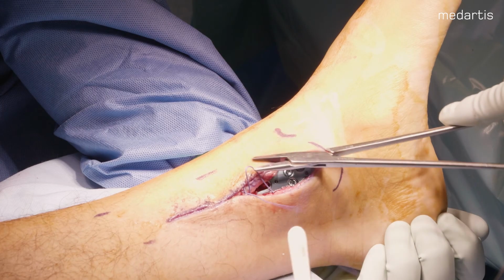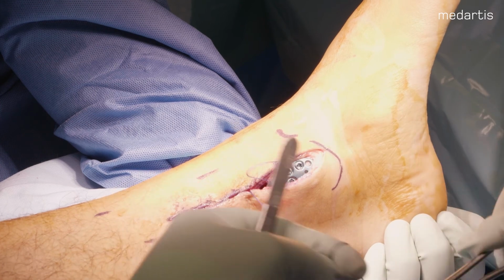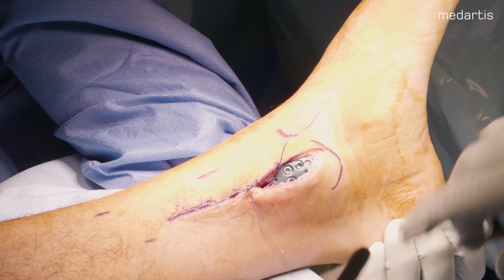Closure. Closure is performed in layers with Vicryl and Prolene.